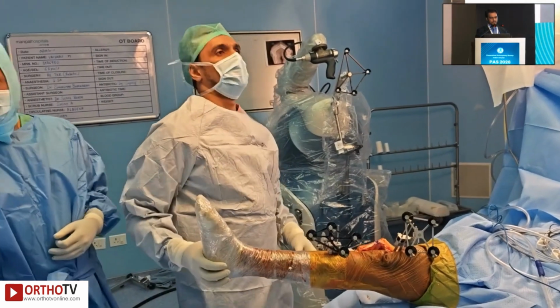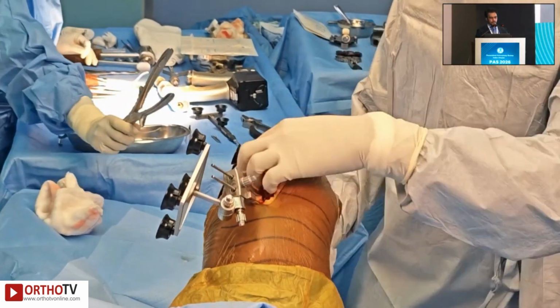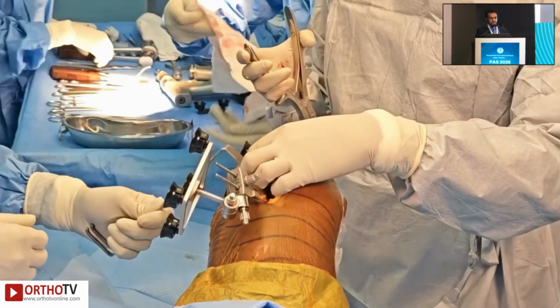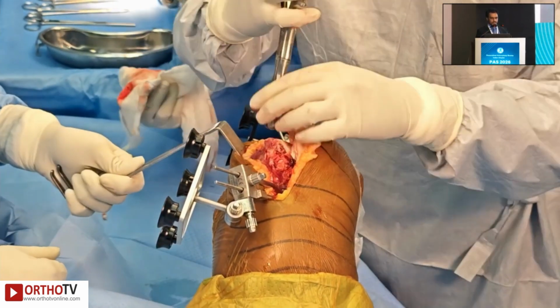What I do is I check the native laxity by just holding the foot off the ground without applying any stress on it. At this point, I take away the osteophytes, especially the ones which are tenting the MCL.